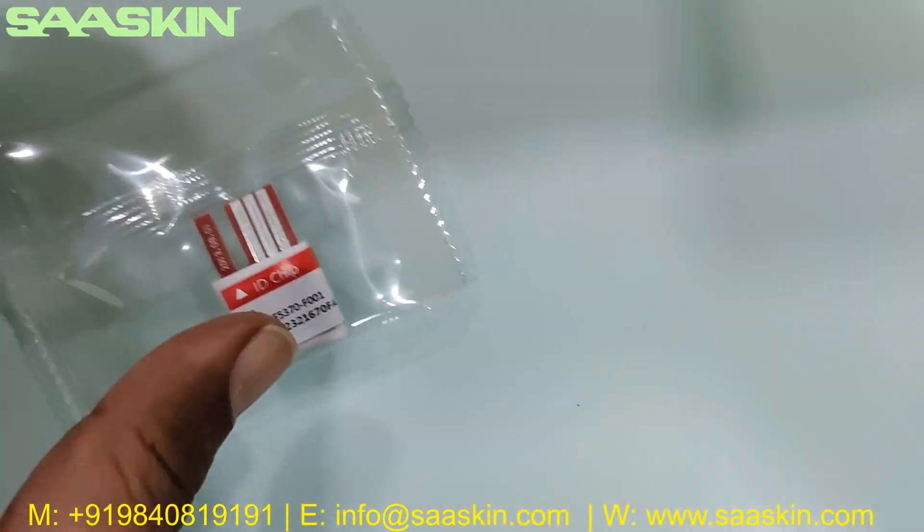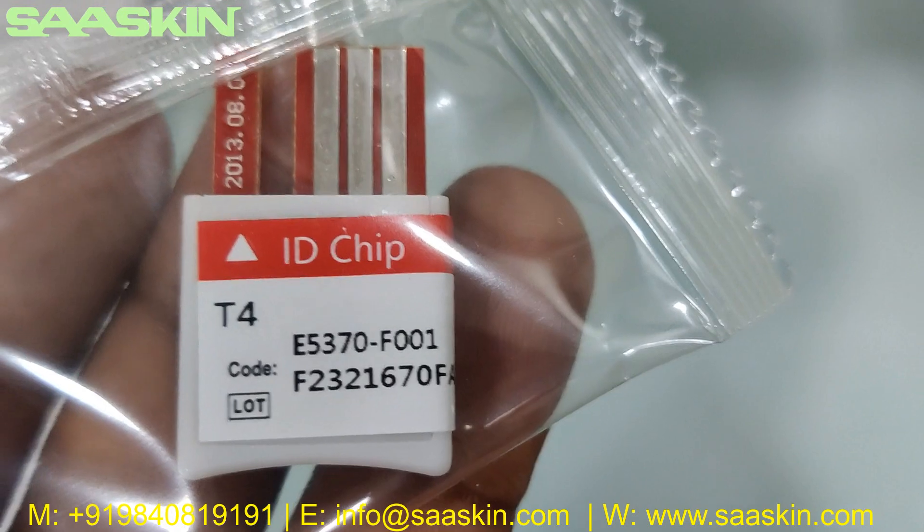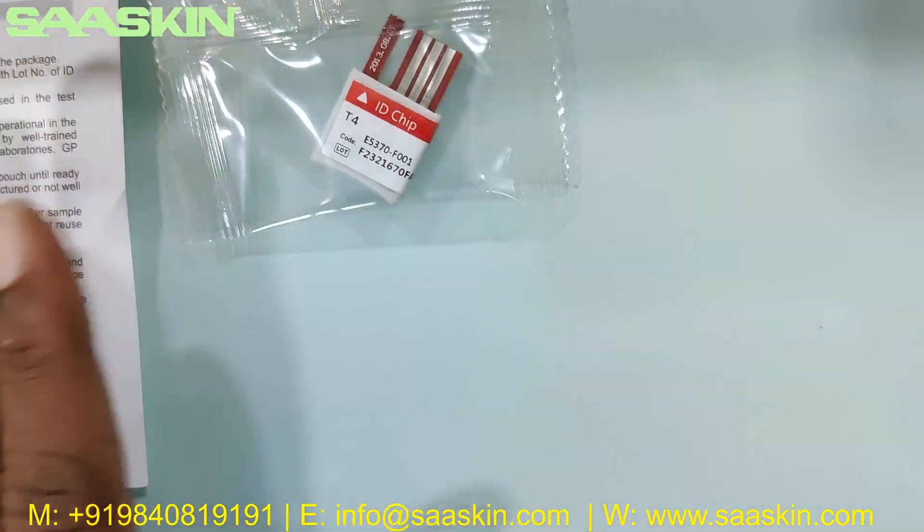Then you get an ID chip. You can see the ID chip which says T4, and you have the code and also the lot number that matches with the box.